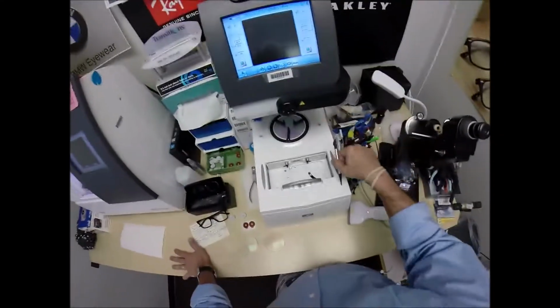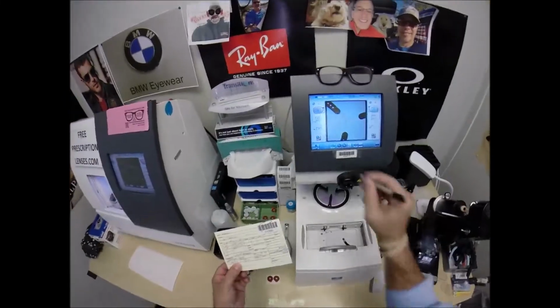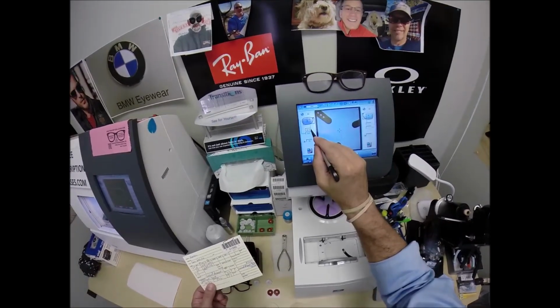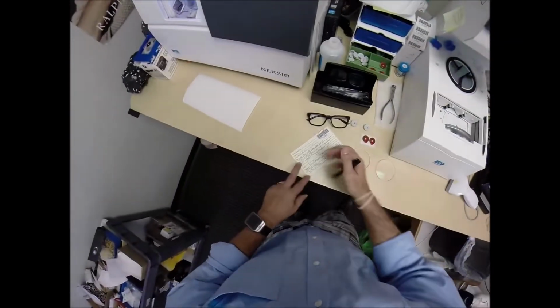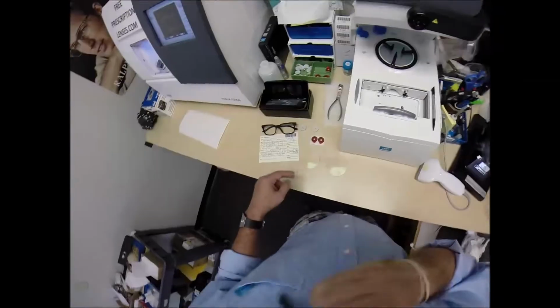We're going to move on to the next screen. Enter your pupillary distance, which is 32 for each eye. The computer starts at 32.5, so only tap the minus button one time because it goes down in 0.5 millimeter increments to 32. I do want to raise the optical center height up to 22. Let me go ahead and mark that. We're going to go 2.5 above to 22 millimeters high.